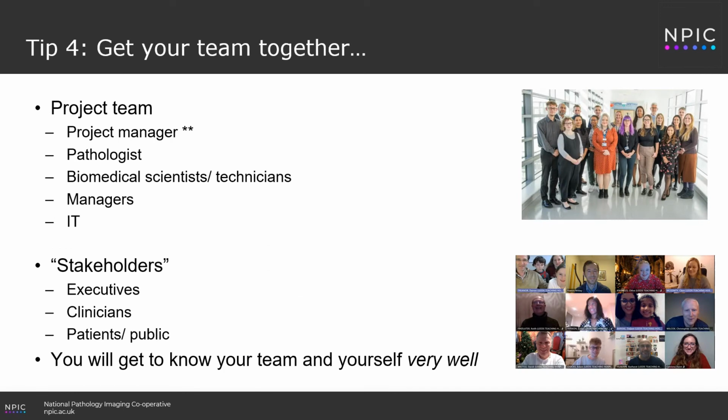If I was to give one tip to overrule all tips, it might be number 4. Get your team together and get the right team together. You will need a substantial project team with external help. Pathologists are not familiar with project management, and you need a professional project manager, at least one, to manage a deployment in a small lab.